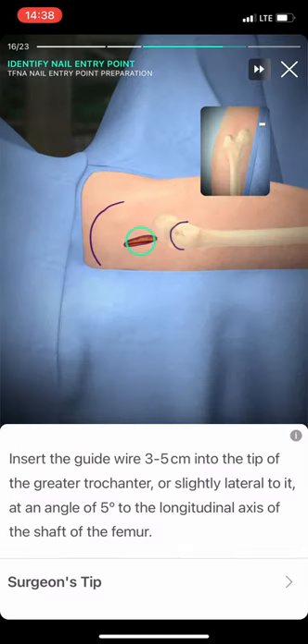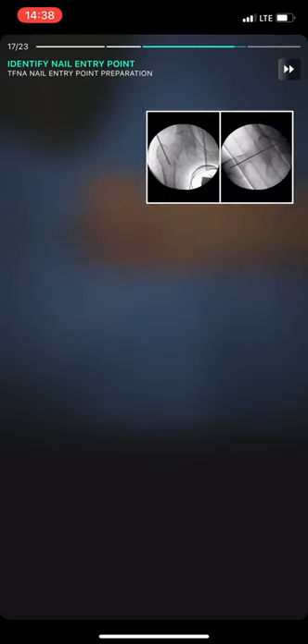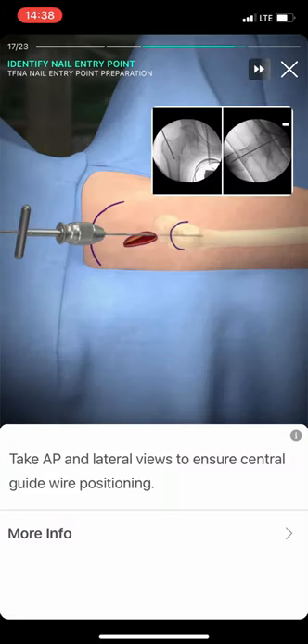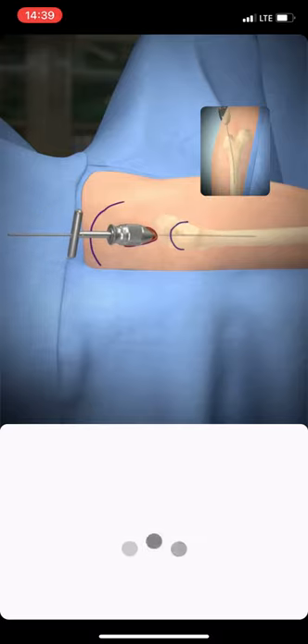Insert the guide wire 3-5 cm into the tip of the greater trochanter, or slightly lateral to it, at an angle of 5 degrees to the longitudinal axis of the shaft of the femur. Take AP and lateral views to ensure central guide wire positioning. Advance the guide wire into the medullary canal, past the fracture, until it is well seated in the canal.